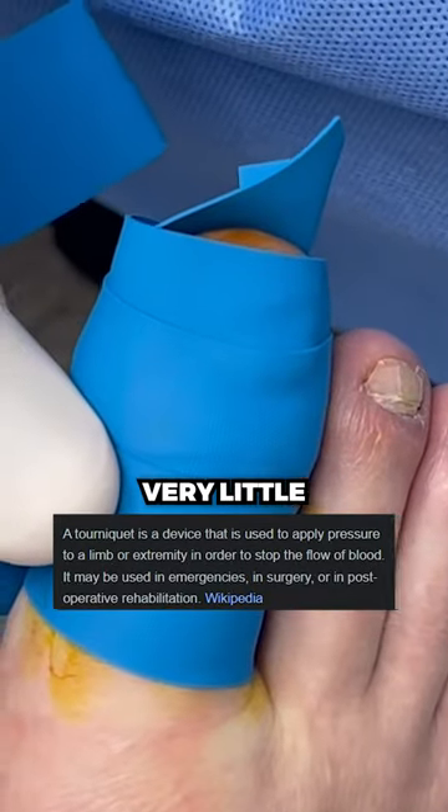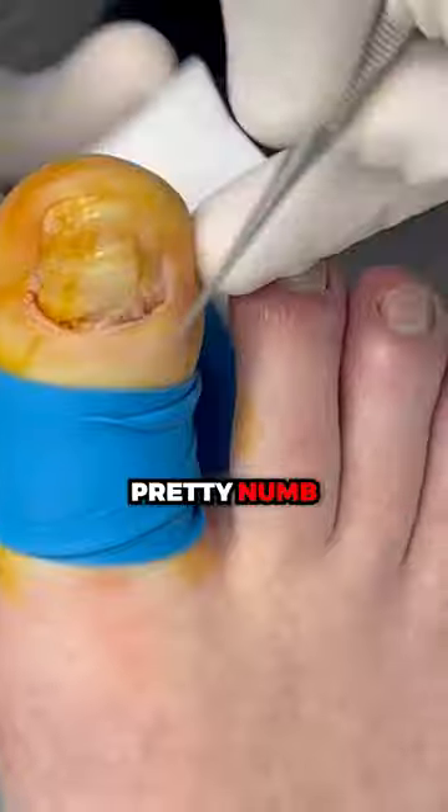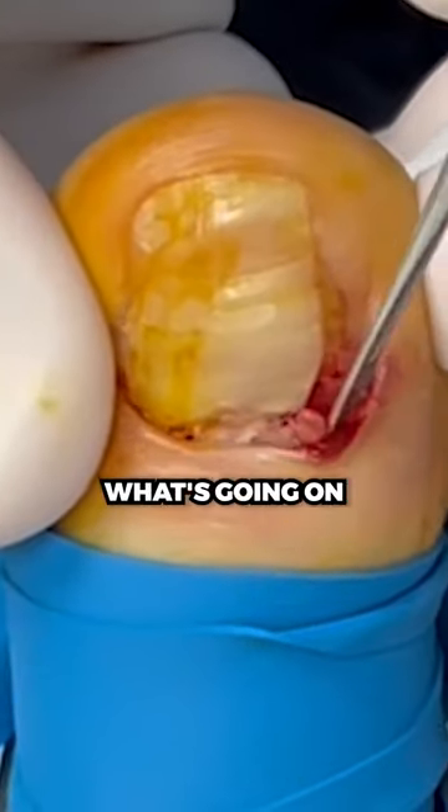So this is a tourniquet, so there's very little to no blood, so we can see everything very clearly. Okay, so you're pretty numb. Just seeing what's going on.